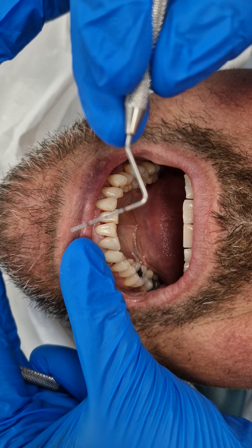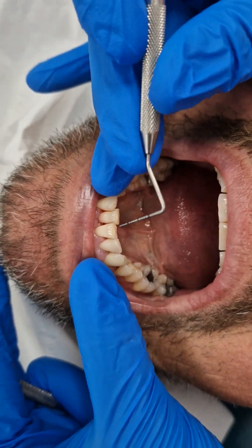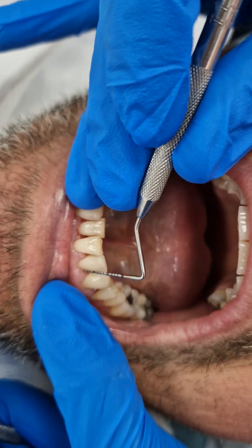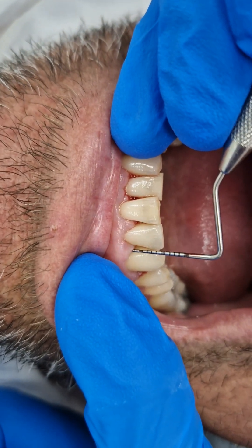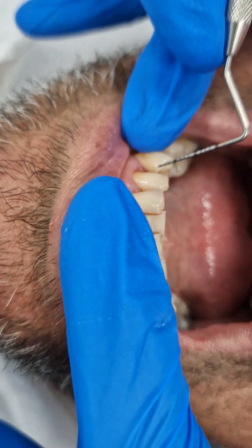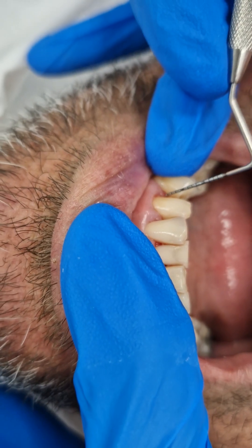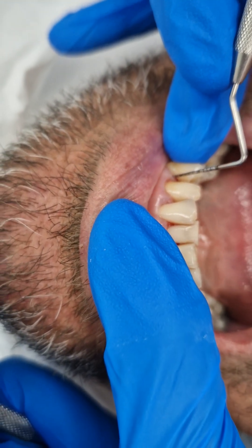I'm going to show you the pockets. I'm using my probe and it's got millimetre measurements. It's showing you that around these areas, the probe dips in under the gum more than it should. It's gone in about five millimetres here and around the canine premolar zone — it just dips in here.